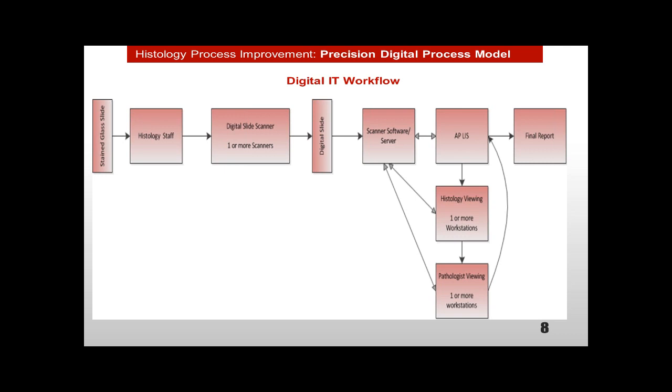Then we have to look at loading the digital slide scanners, whether it's one in your department or multiple, and that decision will be based on what your time factors are and the amount of data that you're going to create. Are you going to create just one digital image per slide? Probably not. Is it going to be 5? Is it going to be 10? Is it going to be 20? There's a lot of coordination and decision process that has to be made. So this is going to be technicians and technologists making this decision. Then you've got the digital slide.